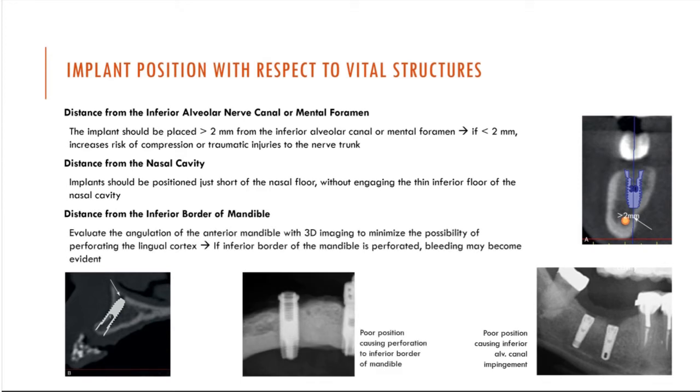As for distance from the inferior border of the mandible, we should evaluate the angulations of the anterior mandible with 3D imaging to minimize the possibility of perforating the lingual cortex, because if the inferior border of the mandible is perforated, bleeding may become evident.